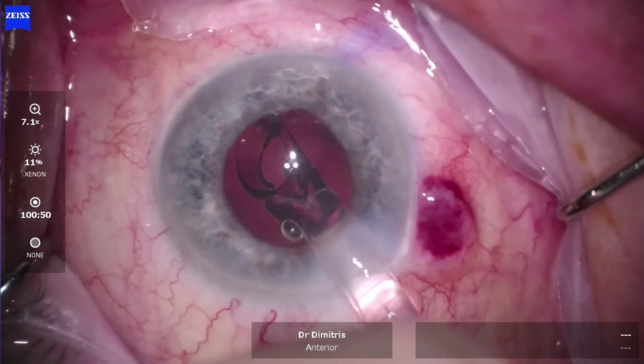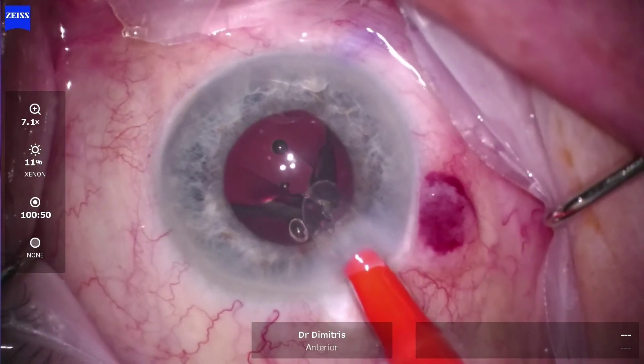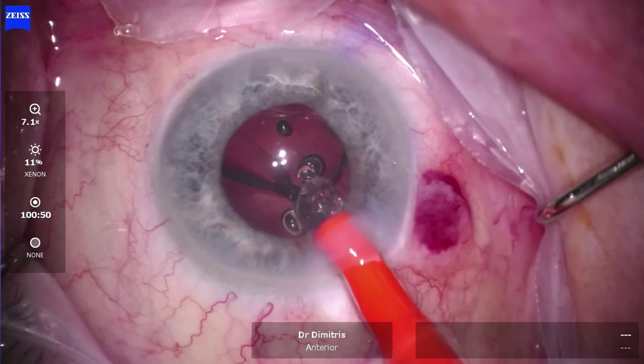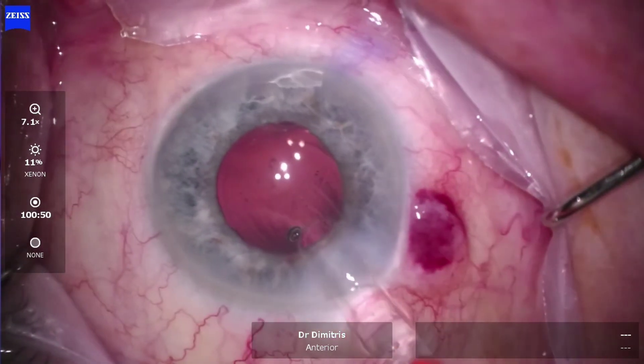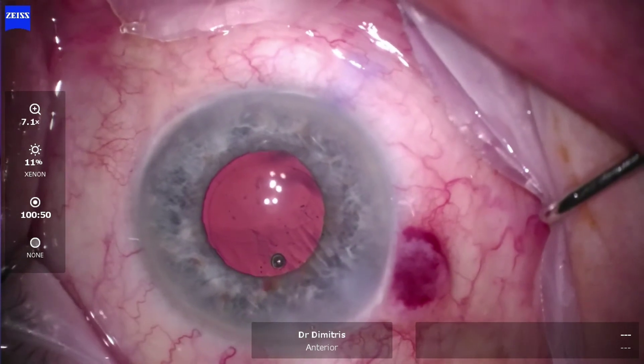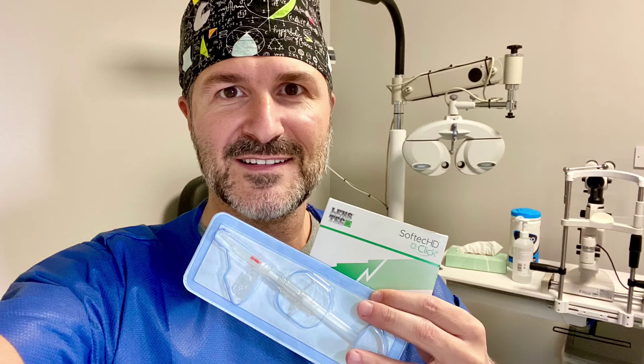There is a smooth gliding action without sticky haptics on the optic surface and no delay in lens unfolding. This beautiful and elegant injection system requires minimal learning curve. It's an easy-to-use, two-step system that affords simple, smooth and consistently correct IOL position all the time. Thank you.